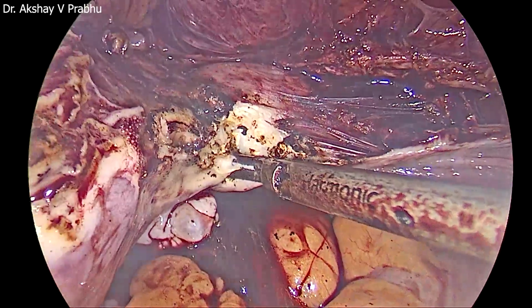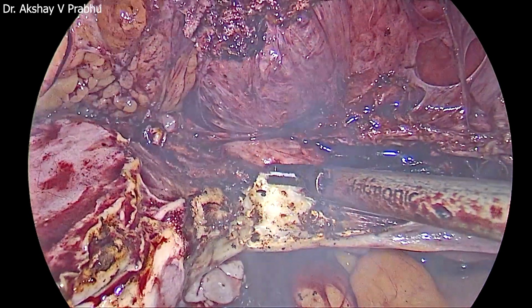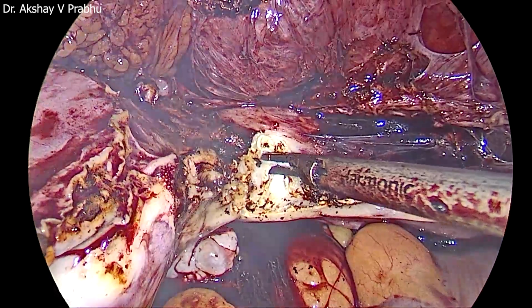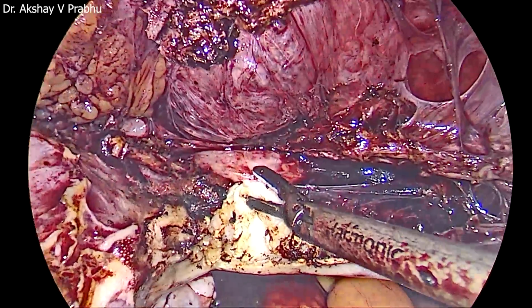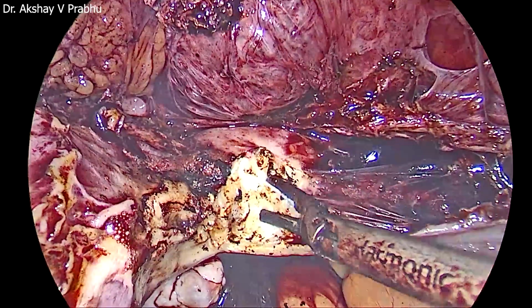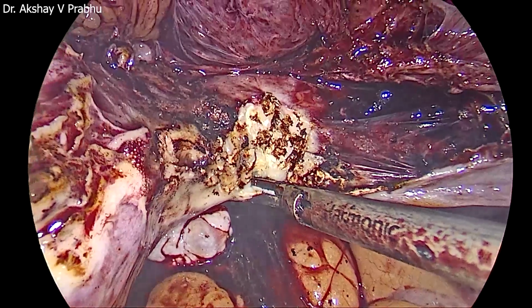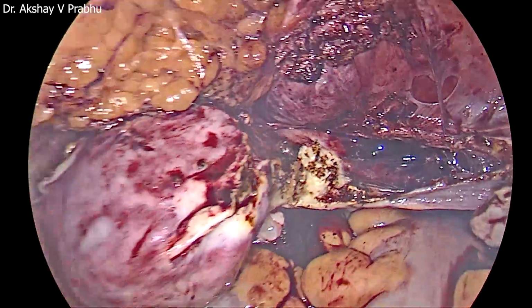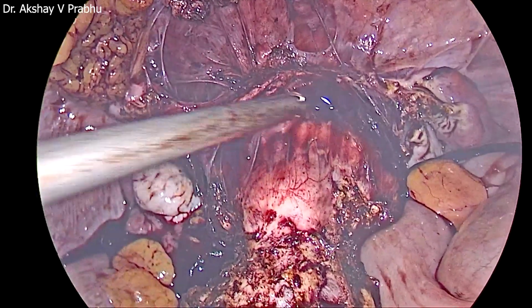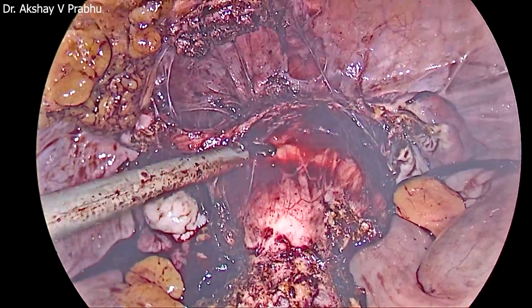In such cases, whenever you have a doubt, it's always good to do the methylene blue test. So what we do is that post removal of the specimen and vault closure, we fill the bladder with saline, methylene blue diluted in saline, at least 250 ml, so that the bladder completely enlarges, and we make sure that there are no micro leaks.